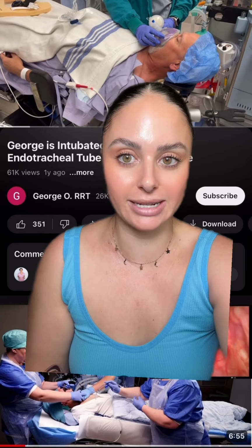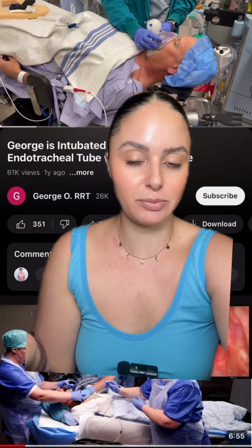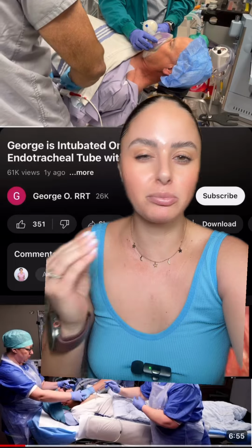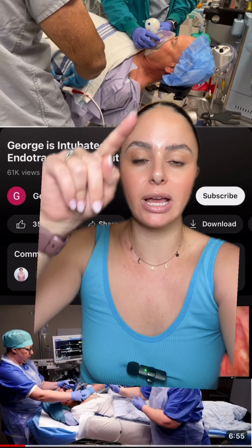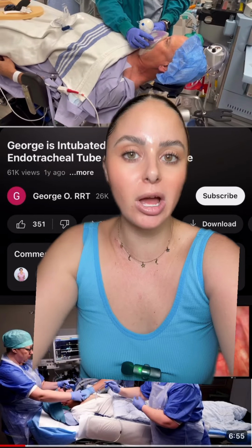So this provider just gave that patient some sleepy medicine. I'm not sure what, but it's a medication to help this patient go to sleep. This appears to be in an OR setting, so slightly different than intubating at the bedside, but pretty similar. He's following up and giving something else. And as you can see, this person here is providing the patient with probably 100% oxygen.